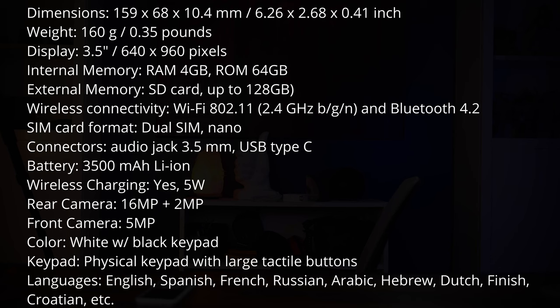The rear cameras are 16 megapixel and 2 megapixel, and the front camera is 5 megapixel. The SmartVision 3 is 4G VoLTE compatible, and here in the US it runs on T-Mobile and smaller networks that use T-Mobile towers, such as Simple Mobile and Mint Mobile. If you purchase the SmartVision 3, you automatically get three months of free Mint Mobile service.